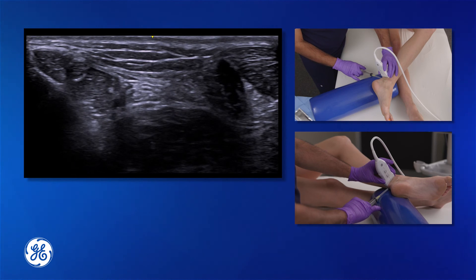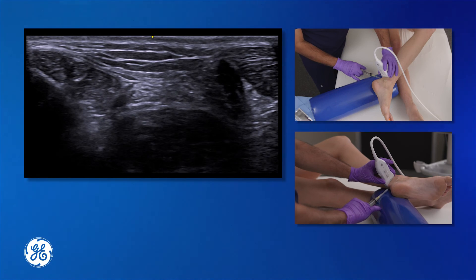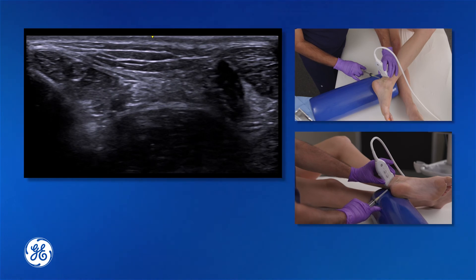After performing this nerve block, the patient can expect 90% of the sole of the foot to be completely anesthetized, allowing for procedures to be performed on the sole of the foot with proper pain control.